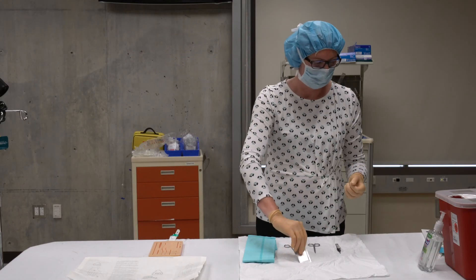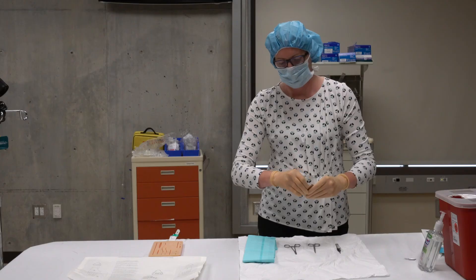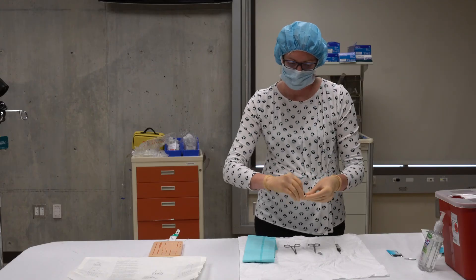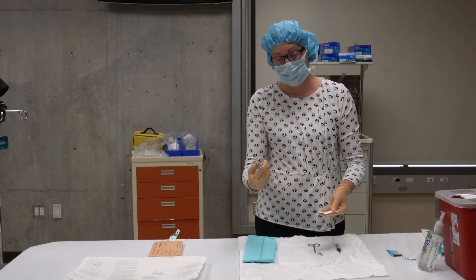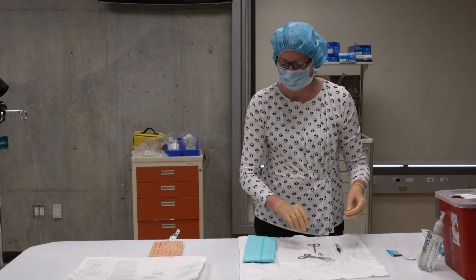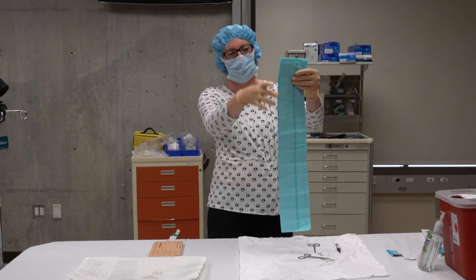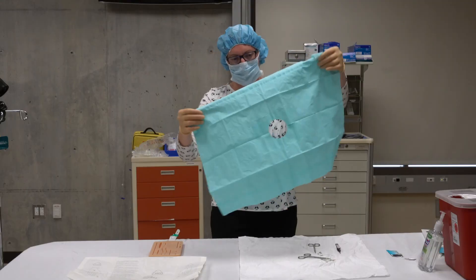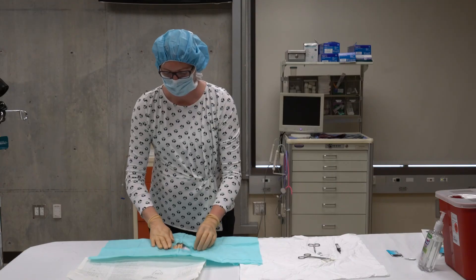I come back over to my sterile field and open up my suture to prepare to suture this wound. I'm going to pick up my needle driver and load the needle onto it, then set that on my sterile field. Now I'm going to set up the sterile field over the patient — I'll pick up my blue drape, which has a hole in the middle, and place it over the laceration so the wound is right in the center.